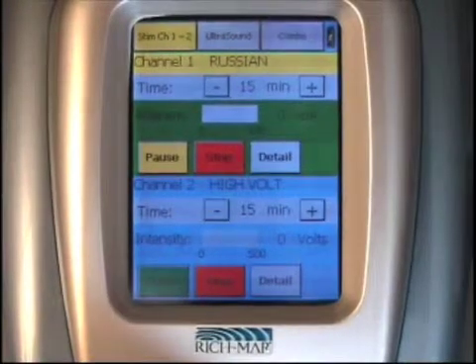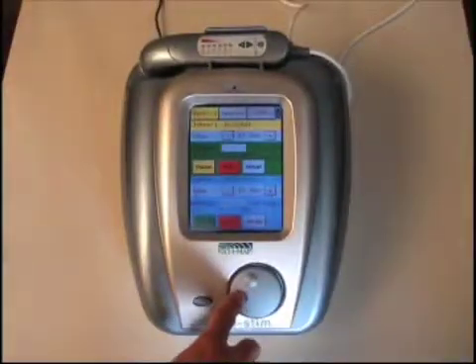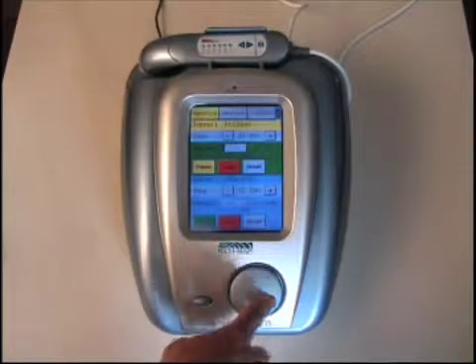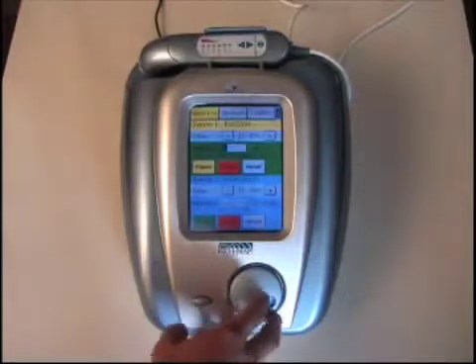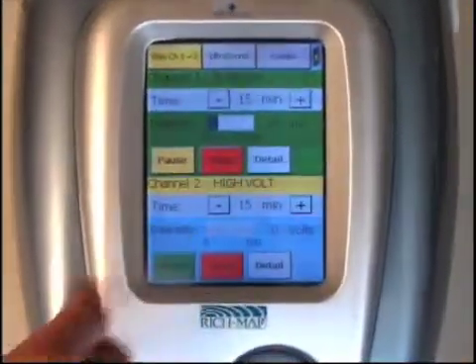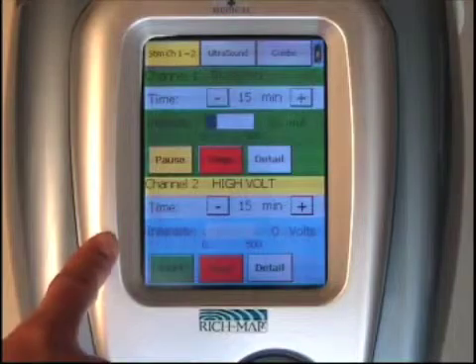The treatment is in progress. To change the intensity, you'll use the manual dial at the bottom of the unit, which will adjust the milliamps from 0 to 100 within the Russian treatment that is running. To select channel two, you simply press on the blue background within the screen, in which the highlighted channel will be in process.